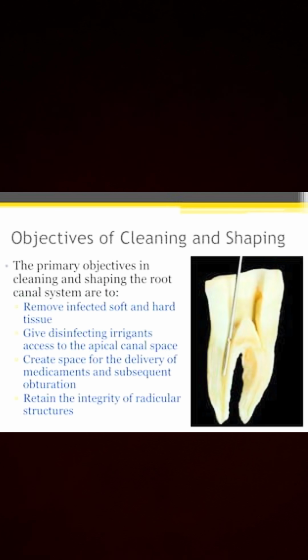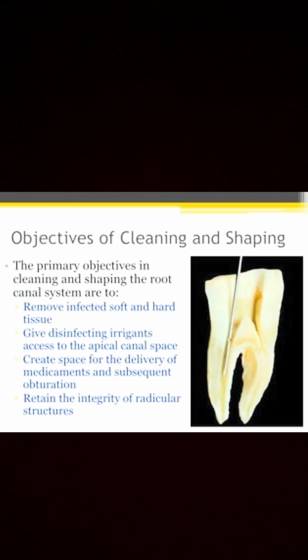What are the components of an endodontic file? Taper. Taper denotes the per millimeter increase in file diameter from the tip towards the file handle. Tapered instruments help in preparing a canal of wider diameter without overenlarging the canal at working length.